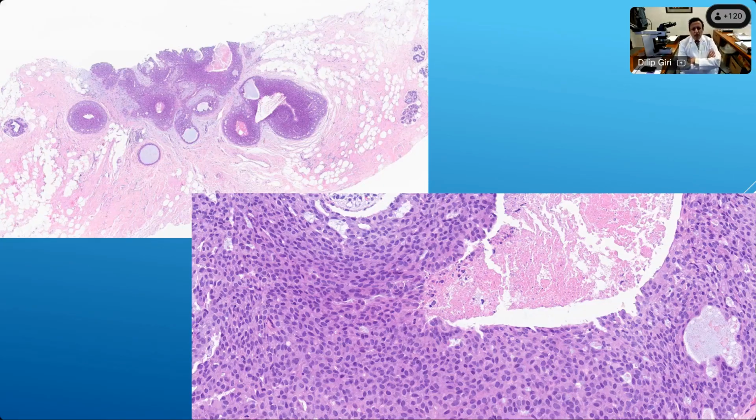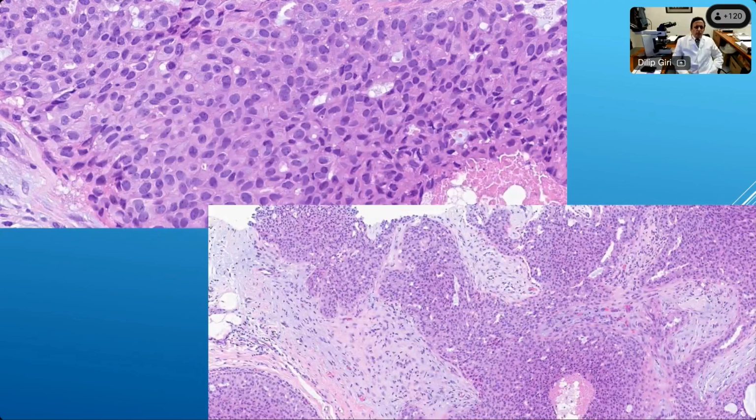Luckily, the case came to us. And of course, since we see these types of lesions pretty much every day, for us, this was not such a difficult problem to resolve. So, you see this kind of darker nuclei here. I was talking to you about maturation. So these cells are very different, right? So you don't expect to see this heterogeneous kind of cell population in DCIS. So regardless of the presence of necrosis, a case like this is really a florid UDH.